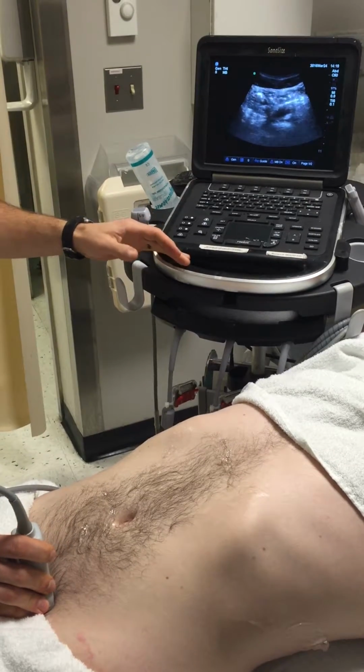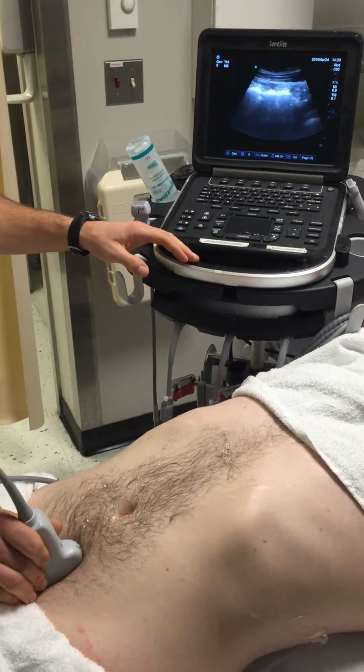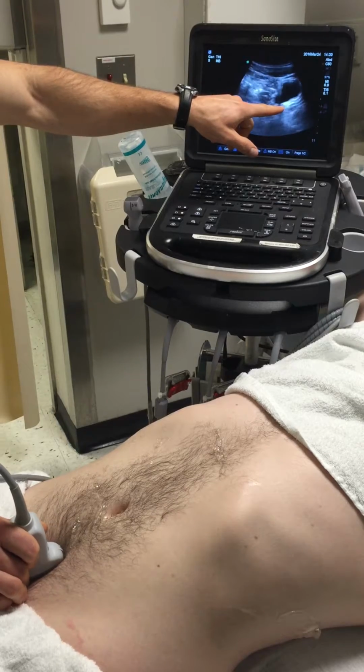Right now the indicator's to the patient's right, and then I'd switch to a long axis view. And same thing, here's your bladder here, and I'd fan patient's right and patient's left.